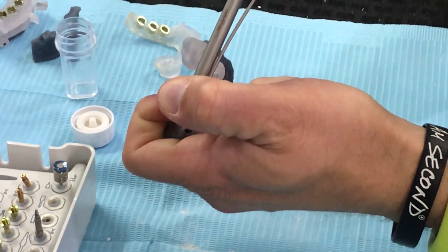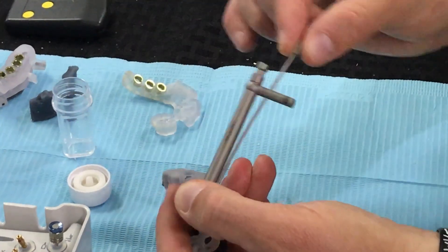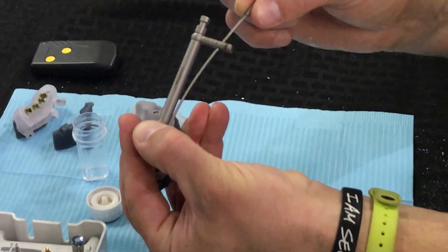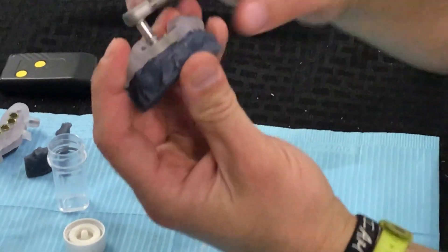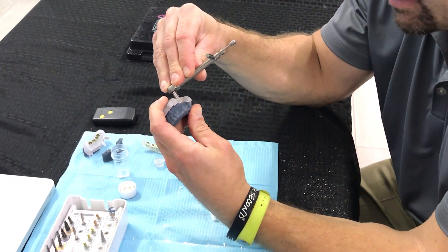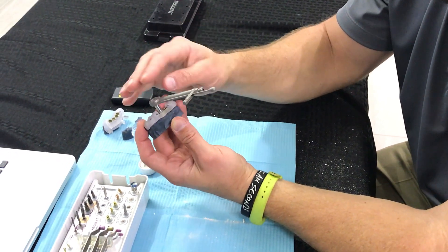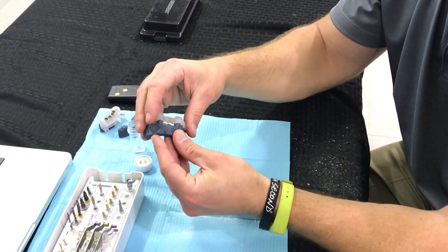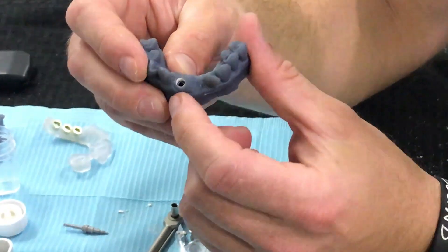I come across and, holding the teardrop on the side of my wrench, I can see I already have primary stability. I'm at 35 newton centimeters and as I get a little further down I'm out at 45 — I'm getting close. I can even finish it off by hand since I'm so close, and I want to line one of the dots up to the facial — and that's it. I have a dot to the facial, my ledge is right up against the sleeve of the guide. I can now remove everything that's here, take my guide off, and I have this beautiful implant countersunk about two millimeters down in the bone in the anterior.